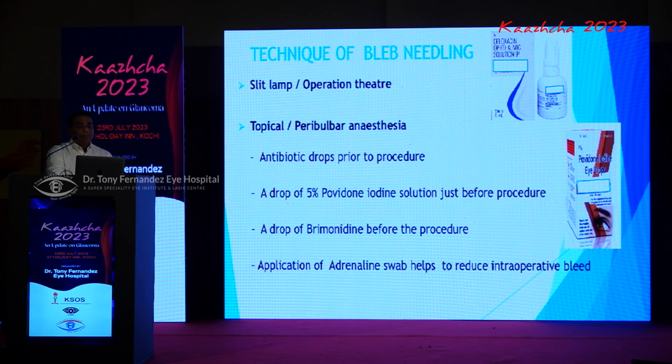So how to do the bleb needling? Either you can do it as slit lamp bleb needling or in the operation theater. I personally suggest first mastering it in the operation theater, especially in countries like India where hygiene is a little bit of a concern. I prefer one should strictly do it in the operation theater.